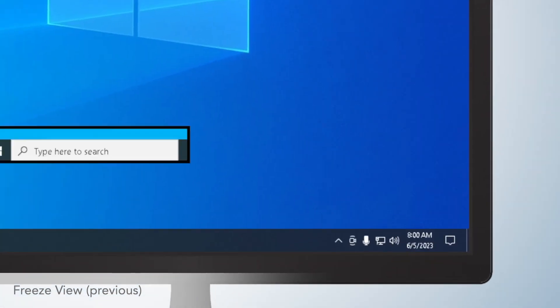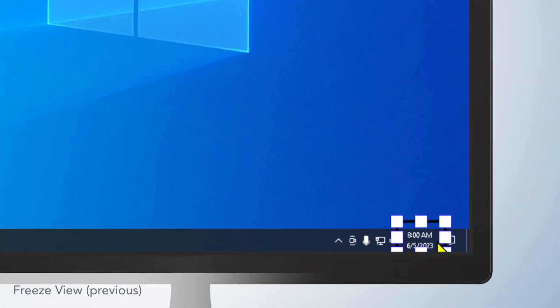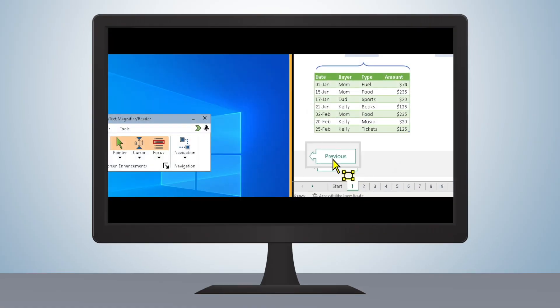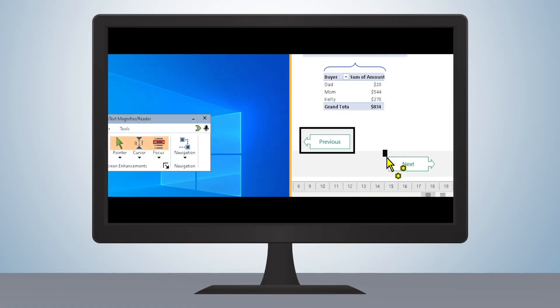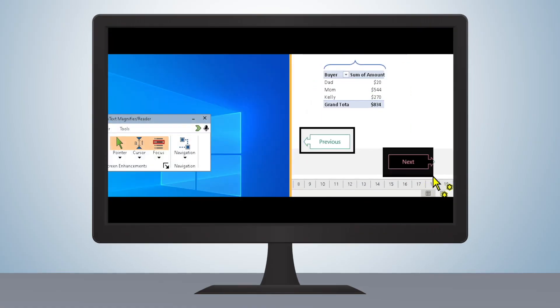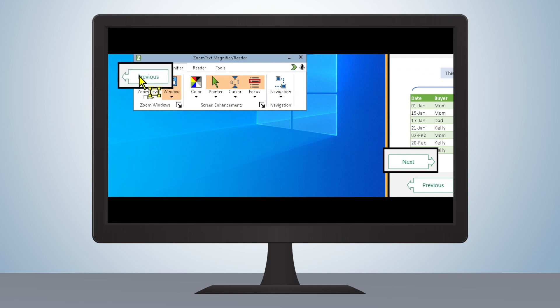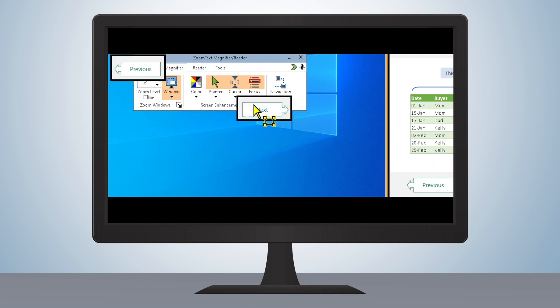Previously, users could only utilize one FreezeView at a time. Now up to four separate FreezeView windows can be defined simultaneously, and they're even allowed to overlap in content and display location, giving users the ability to organize their ZoomText or Fusion experience as they see fit.